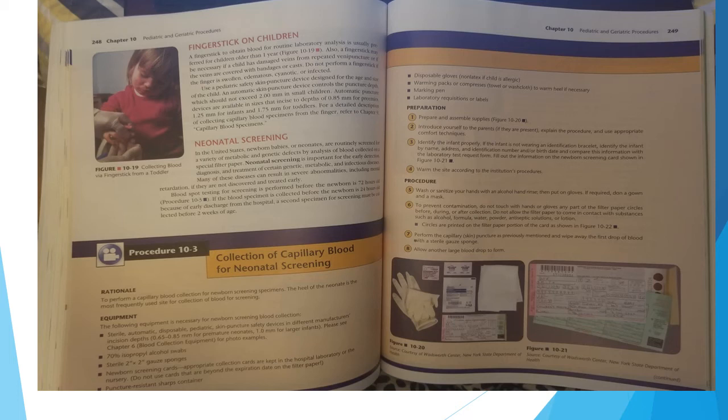Procedure: wash or sanitize your hands with an alcohol hand rinse, then put gloves on. If required, don a gown and a mask. To prevent contamination, do not touch with hands or gloves any part of the filter paper circles before, during, or after collection. Do not allow the filter paper to come in contact with substances such as alcohol, formula, water, powder, antiseptic solutions, or lotion. Circles are printed on the filter paper portion of the card as shown in Figure 1022.